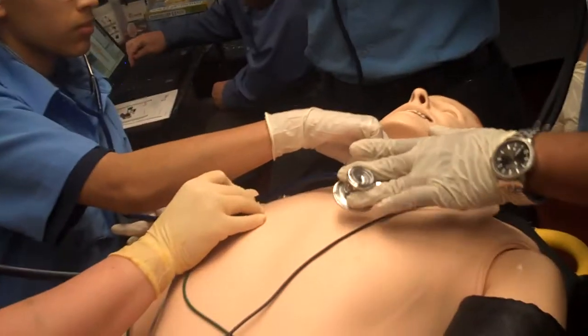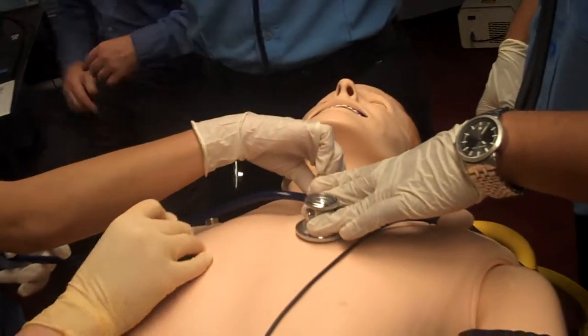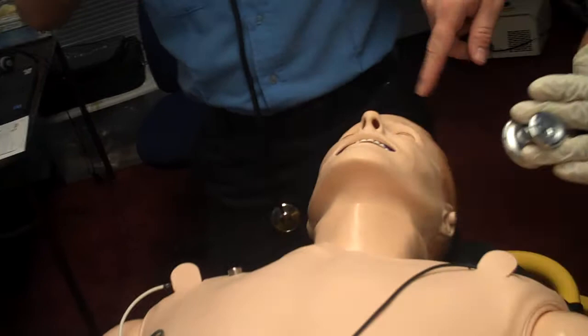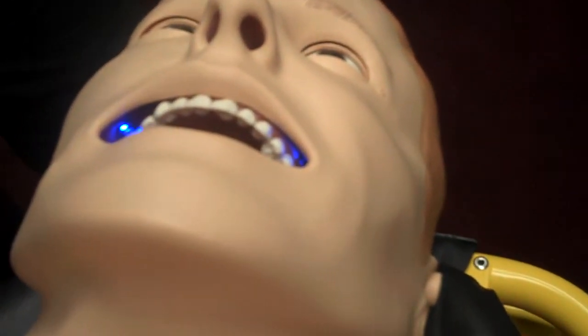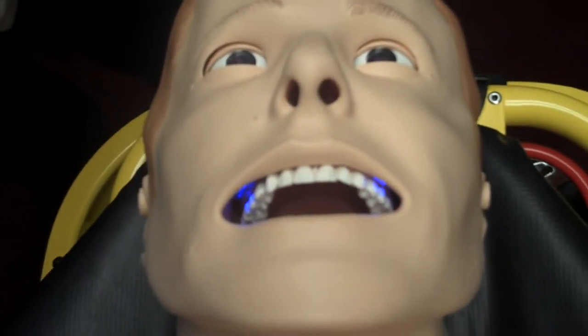I'll do that right now so you can see the cyanosis. Take a look around the lips — you can see the cyanosis around the lips there. Where if he's hypoxic, you can actually see that on the mannequin.